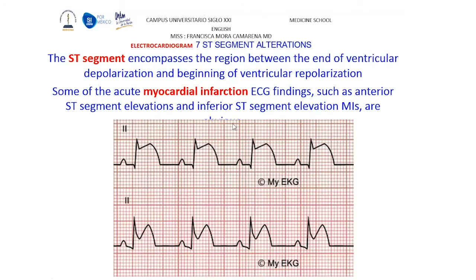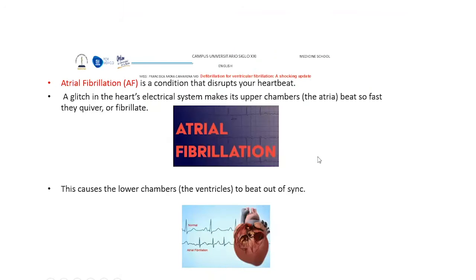Like for example, when we have a patient with a myocardial infarction, those findings are very specific. The ST segment elevation is very significant.